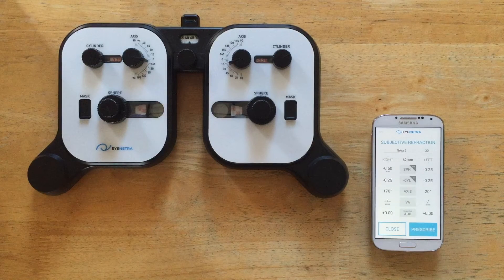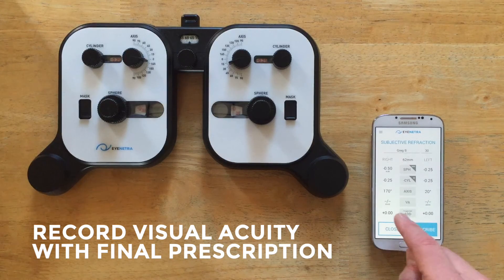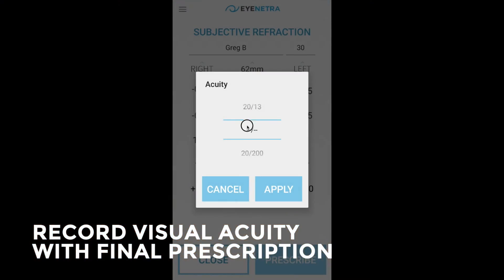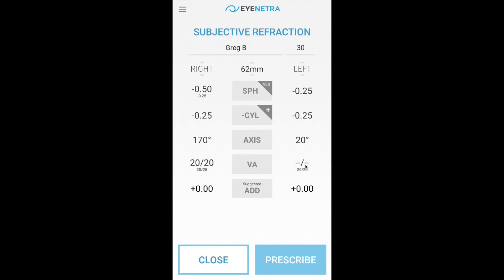Now the last step before prescribing is simply to record the corrected visual acuities with this final prescription. So on the right we're down to 20-20 and on the left down to 20-20.